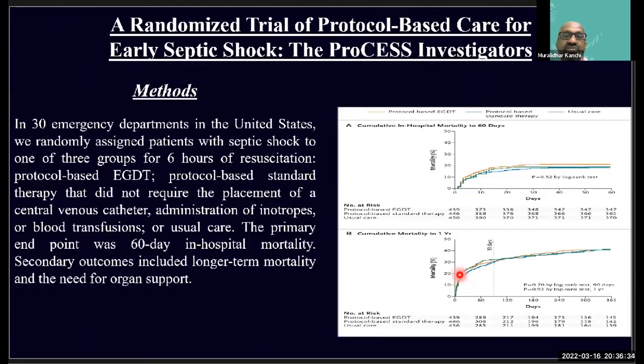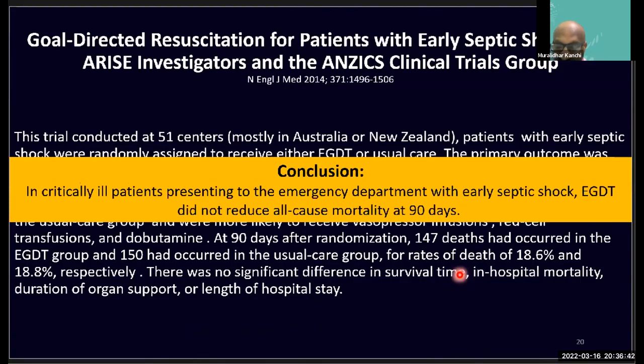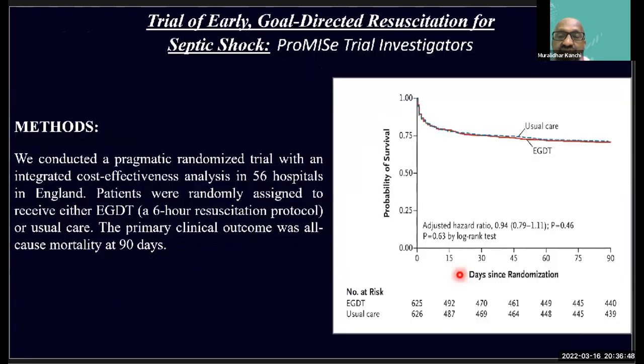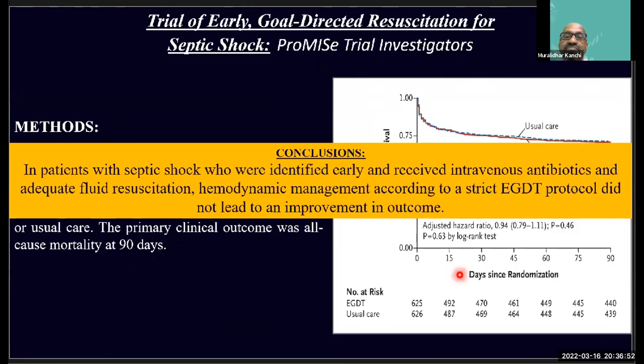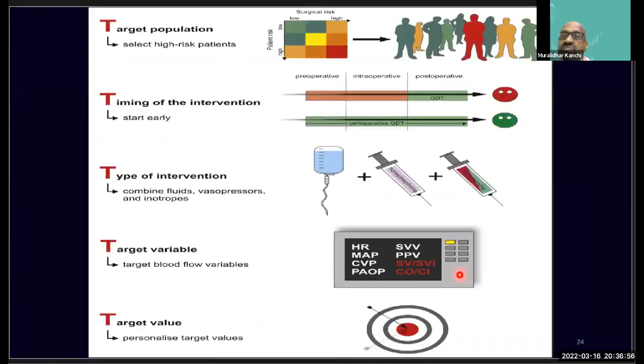These are some of the evidences which show that goal-directed therapy works. But now we know that with goal-directed therapy, especially in critical care units, there's no difference between early goal-directed therapy and usual standard of care. This was already mentioned by Satyam, so I'll not repeat this.